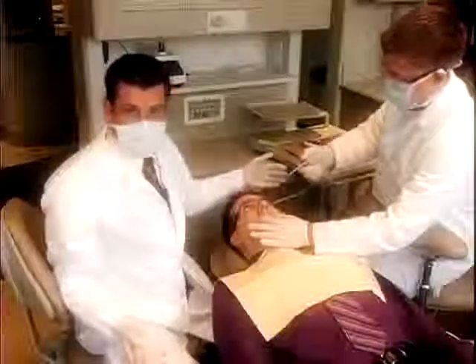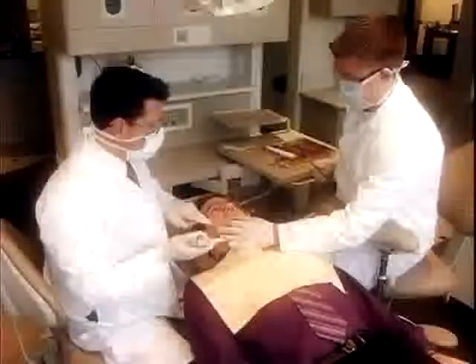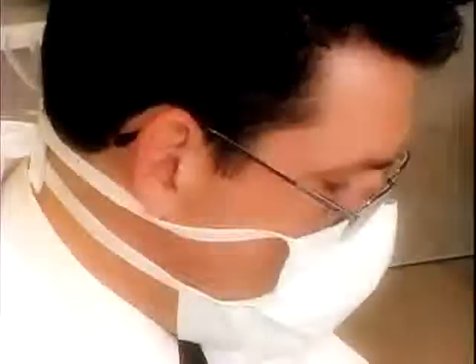We're going to begin today by drying off Randy's teeth. We're going to start with our first placement on Randy's front tooth. Our objective with Randy's teeth is to create an increase in scale, both in length and in width, so we can close out the spacing.